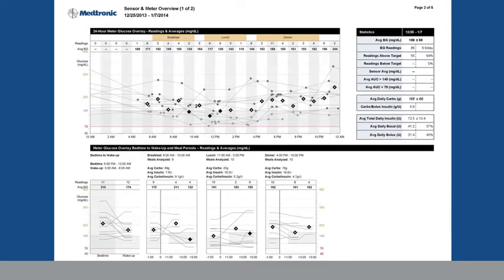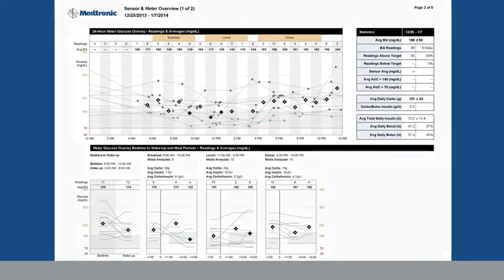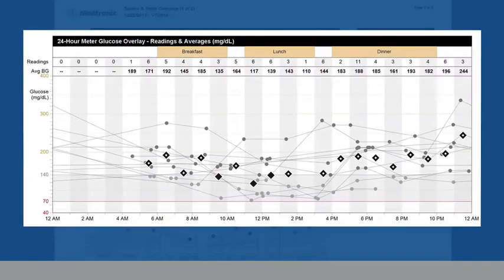There's a lot to look at, so Connor starts at the top, focusing on the graph with all the dots, the 24-hour meter glucose overlay. He looks at the dots that represent his blood glucose readings and sees if there are any patterns. He notices that most of his glucose falls outside of the gray shaded area which represents a normal range, 70-140 mg per deciliter.